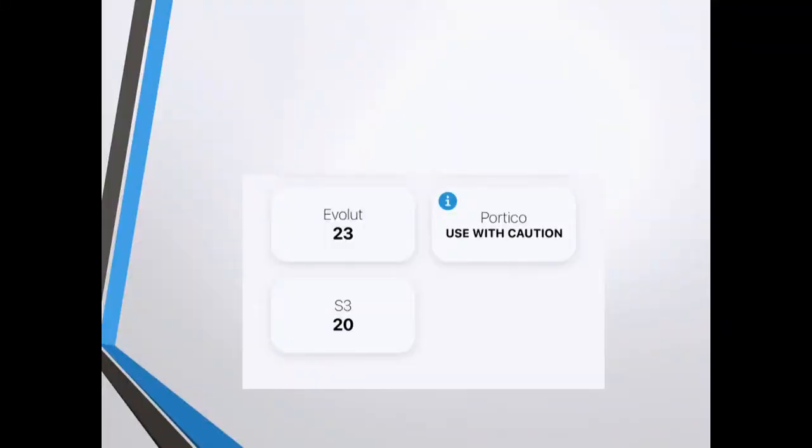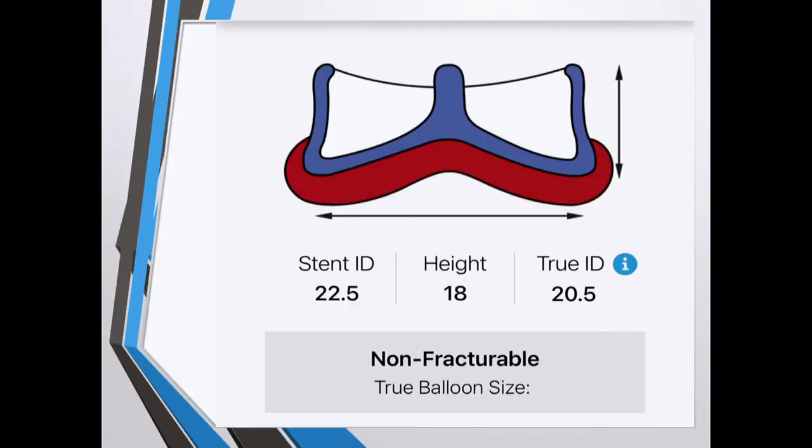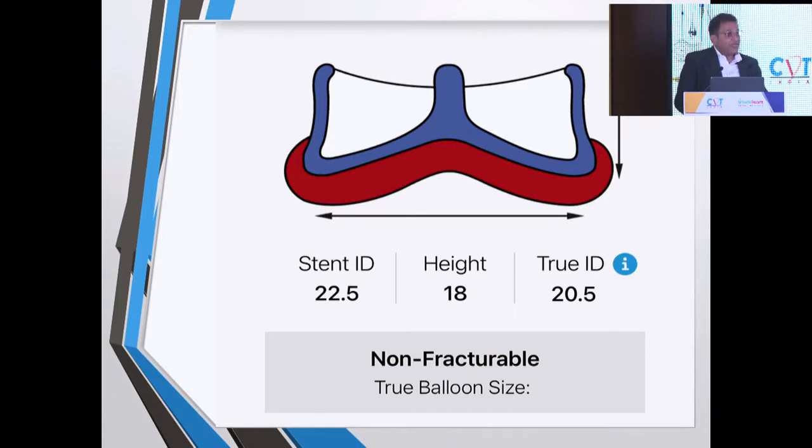Because when you put two valves, there's always a risk that TMVR itself can cause LVOT obstruction. Here you're going to put two valves in. So this analysis confirms the valve we had, and the new LVOT seemed okay. So we knew the TMVR would be safe in such a patient. After the CT analysis, this was the true ID of the aortic valve. So the valve that would fit was an Evolut 23 or a S3 20. Since it's a valve-in-valve with a small valve, we went for a self-expanding valve. And the mitral valve had an inner ID of 20.5, which would go with a Sapien or a MyVal 23.